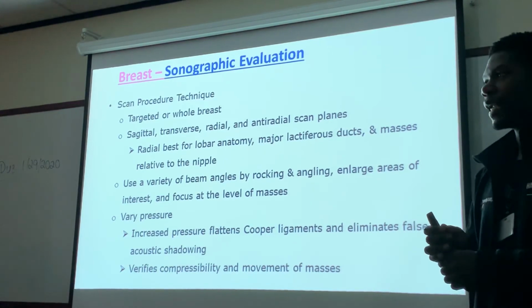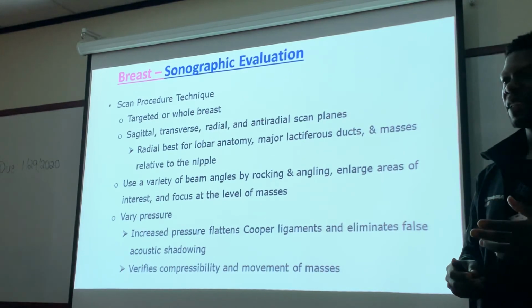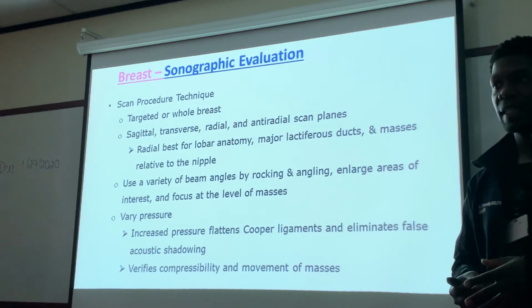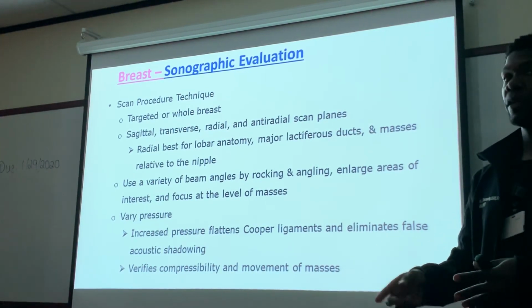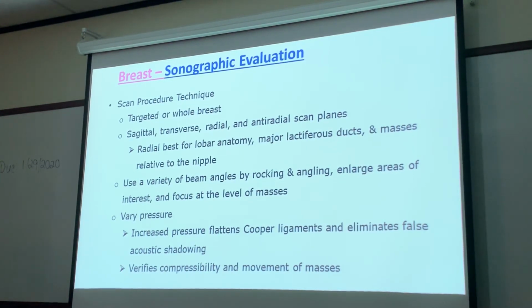It's technology you're going to learn as being new, but it's new to ultrasound, not necessarily new period. You know what I mean? When you guys are on breast, make sure you pay attention, because they do use that elastography technique. There are two different kinds. I'm going to cover the one about shear wave, and we're going to talk about it in physics as well. I just want to introduce it right now. That's kind of the compressibility factor. Just like Color Doppler, it's an add-on that you can add to your machine. Not every machine has it, because it may cost like $20,000 to have that technology on it.